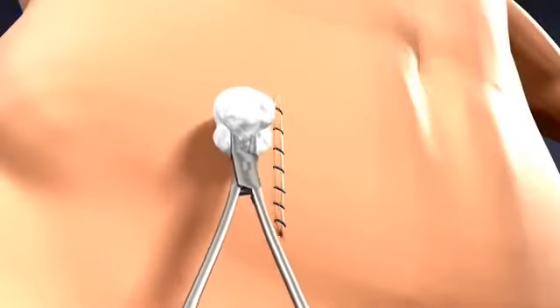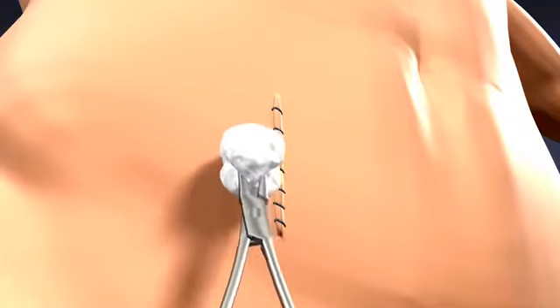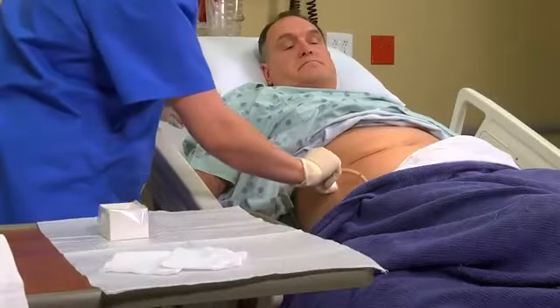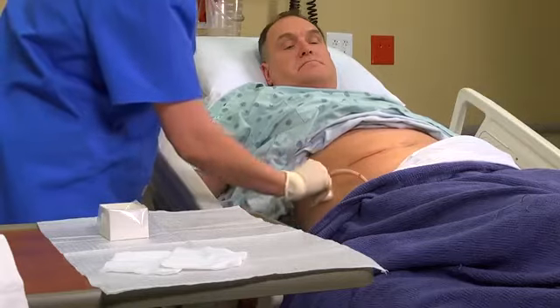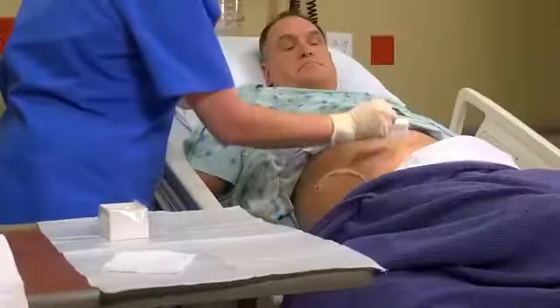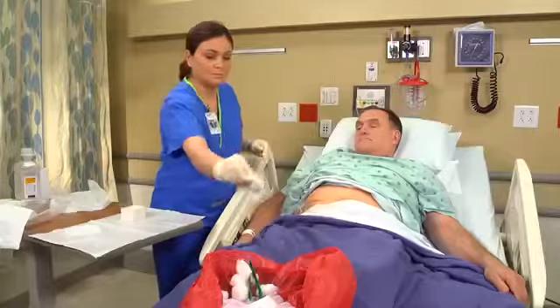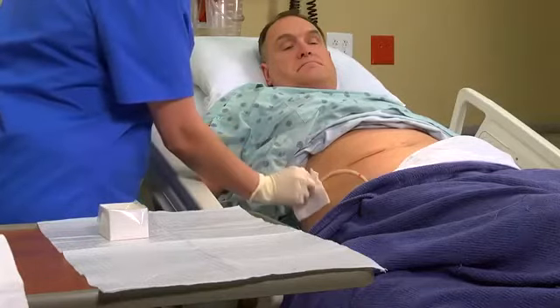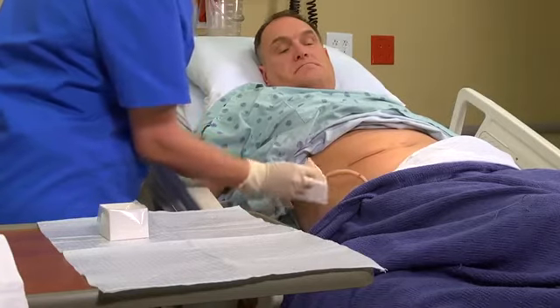As you cleanse the wound, work from the area of least contamination to the area of most contamination. If the patient has a drain, cleanse around it using circular strokes, beginning near the drain and moving outward away from the insertion site. Blot the wound dry with gauze, holding it either with forceps or in your fingers while wearing sterile gloves, whichever technique you use to cleanse the wound. If ordered, use a similar technique to apply antiseptic ointment.